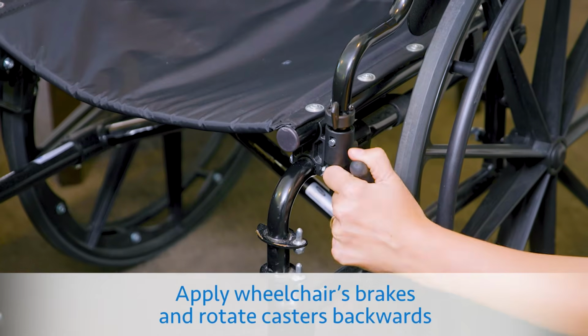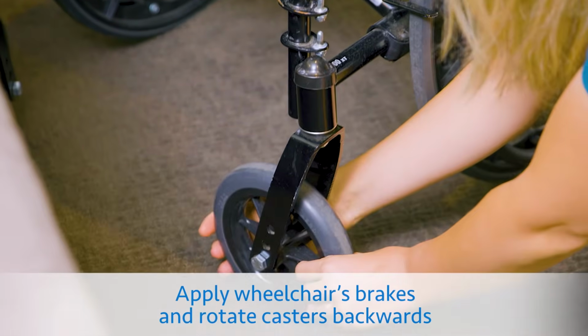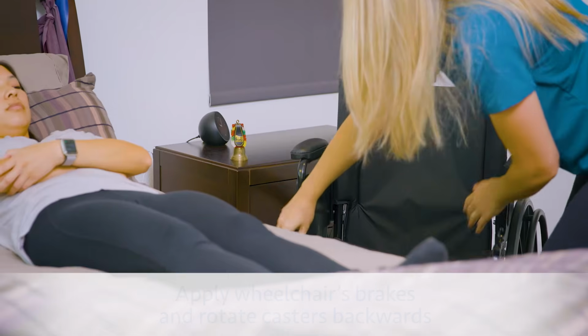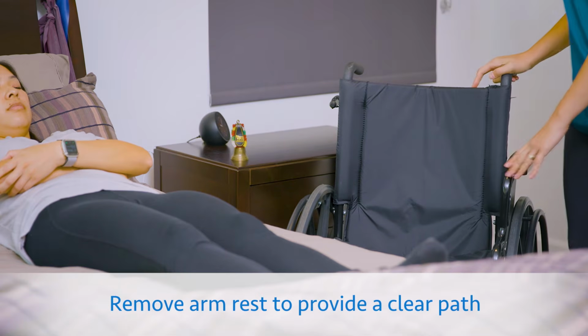Apply the brakes on the wheelchair so that it does not roll away, and make sure the wheelchair's casters are rotated backwards so they are not a tripping hazard. Then, remove the armrest to provide a clear path for the transfer.